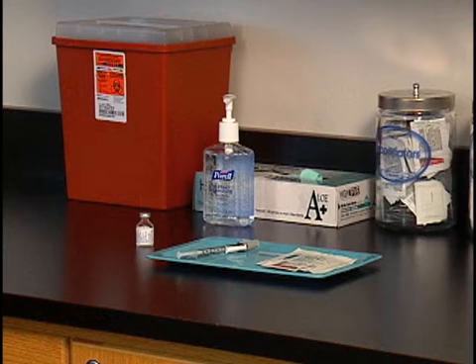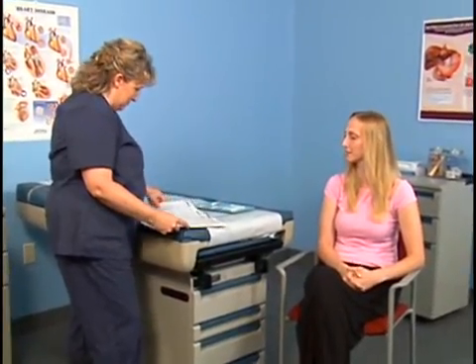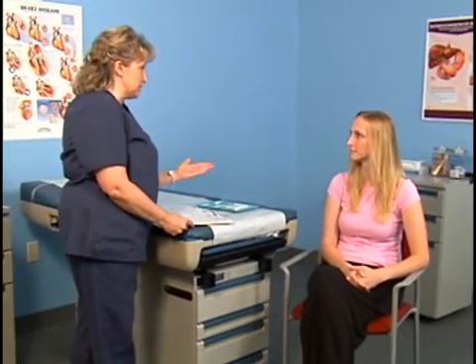Once you have prepared the medication, place the syringe on a tray along with an antiseptic wipe and a gauze pad. Greet the patient and introduce yourself. Hi, I'm Diana. Identify the patient by full name and date of birth and explain the procedure and purpose of the injection. The doctor wants to give you a TB injection as part of your physical exam.